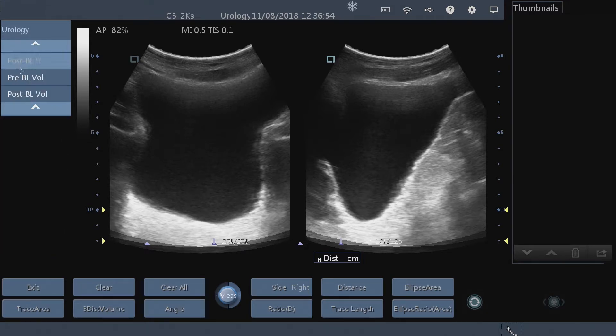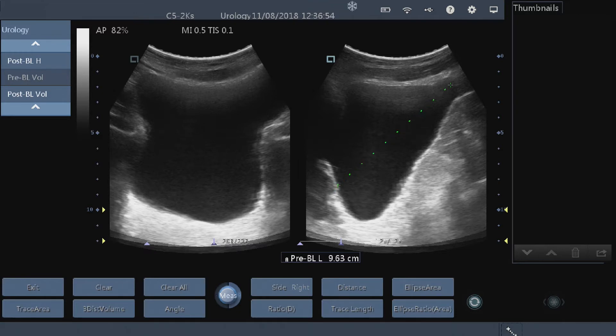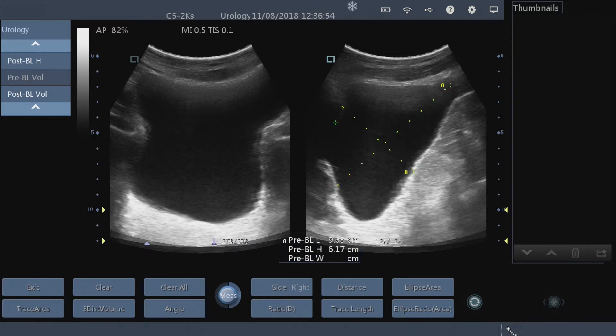We go to the bottom and we're going to take the pre-bladder volume. From pre-bladder volume, we're just going to take measurements across the bladder in three distances.